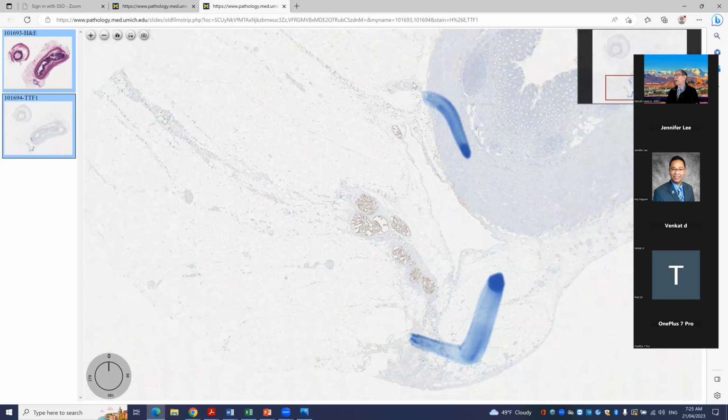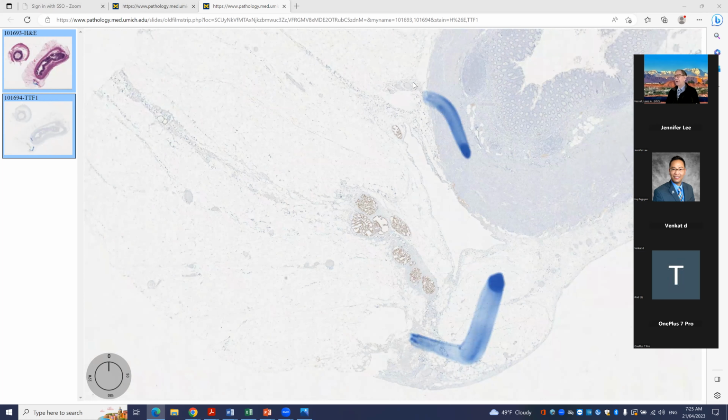So let's see, we have a couple of questions in the chat or comments. Very good. Metastatic neuroendocrine tumor, mets from the struma ovarii. The surface epithelium had serrated areas. I don't think so. I think that's more the type of changes that you get fairly typically with thyroid epithelium. So very good questions and challenging thought processes with this case. All right, well, let's go on to case number 3 and pull that up.